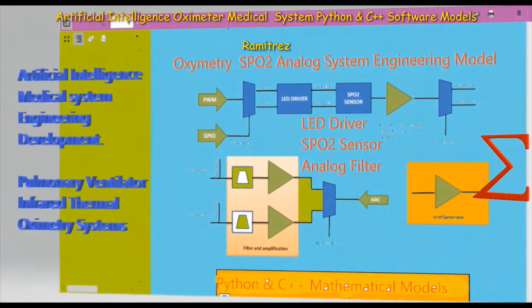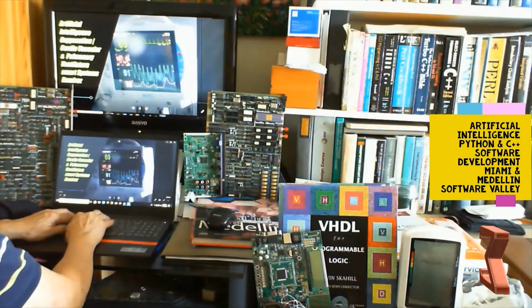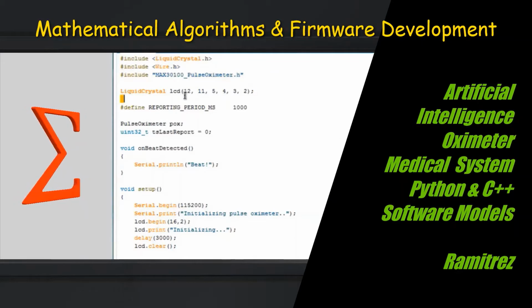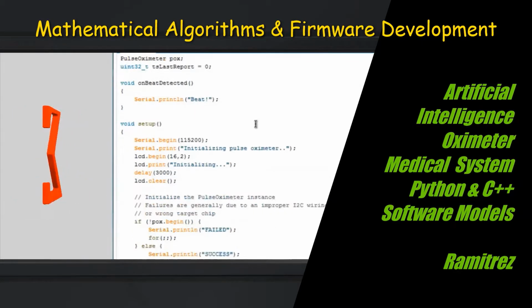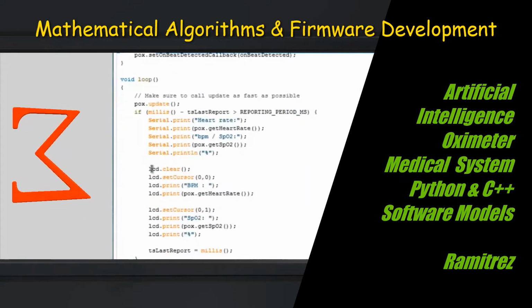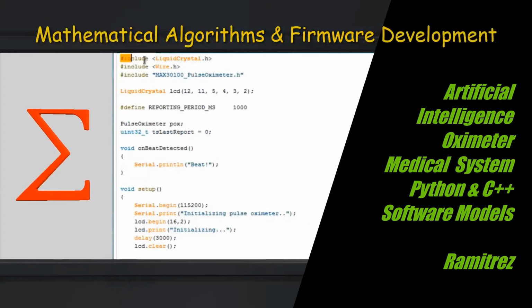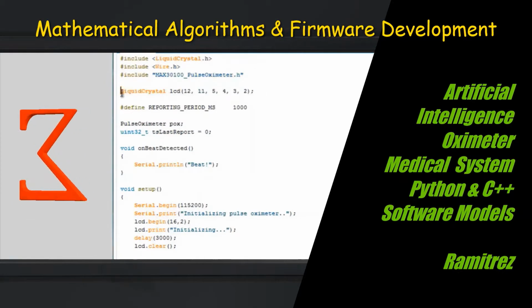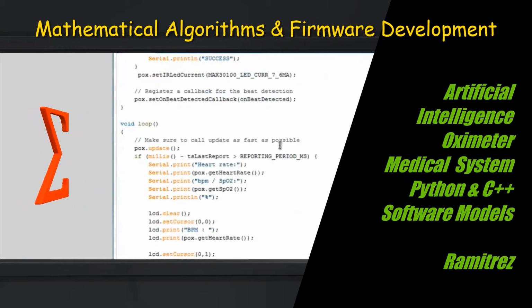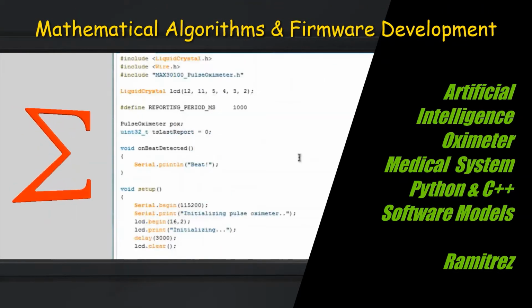The initialization software module resident in the firmware initializes the basic functions of the neuromorphic CPU system, such as clock initialization. First, the function copies the vector table to RAM, that is memory, and clears any pending interrupts on the USB. It enables interrupts from the USB module. At this point, the phase-lock loop initialization is called.